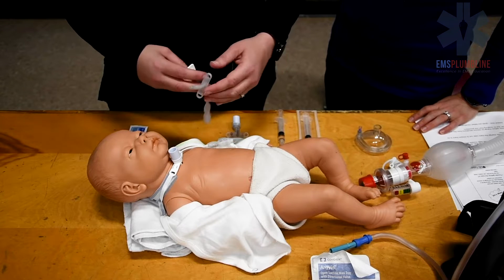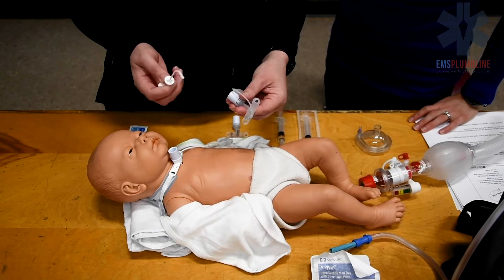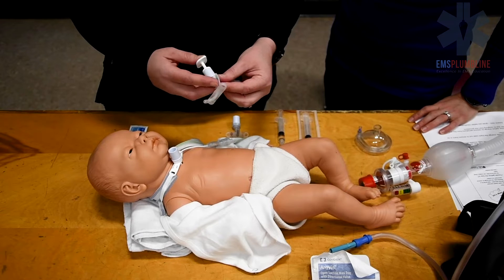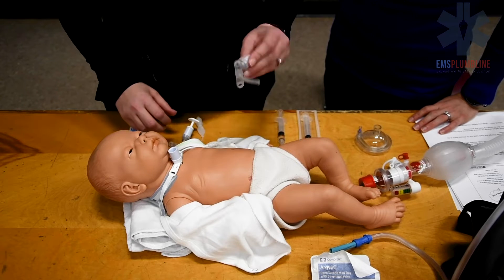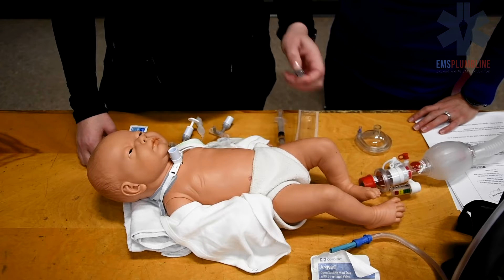Important supplies to have for a trach change include the same size trach and the obturator. The obturator is a rigid guide used to place the trach tube. The size smaller trach also needs to be available in case you are unable to insert the primary trach tube.